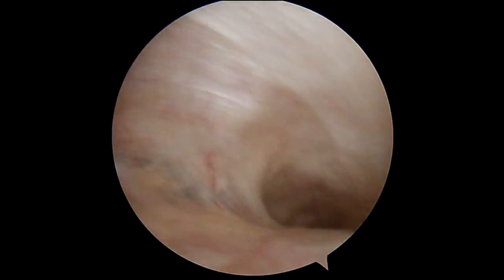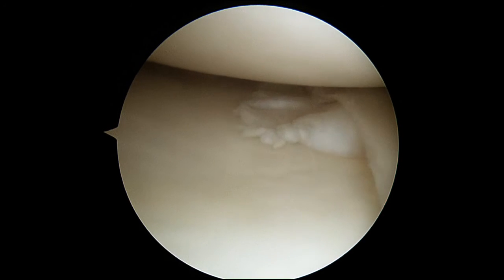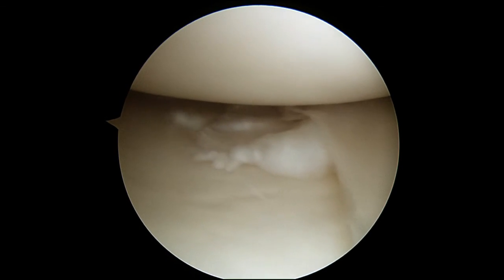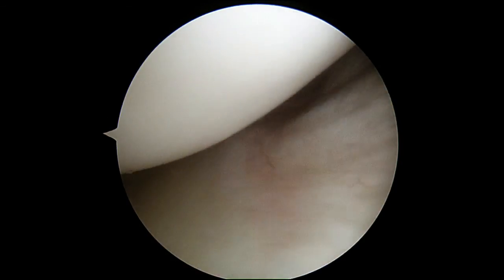Now we're going to look towards the inside part of your knee. There's the medial gutter — that also looks normal, a little bit red but nothing too bad. And right away I can see the cartilage tear. There's your meniscus tear, and that's a little bit more than what the MRI showed, so I can see how that could continue to bother you.